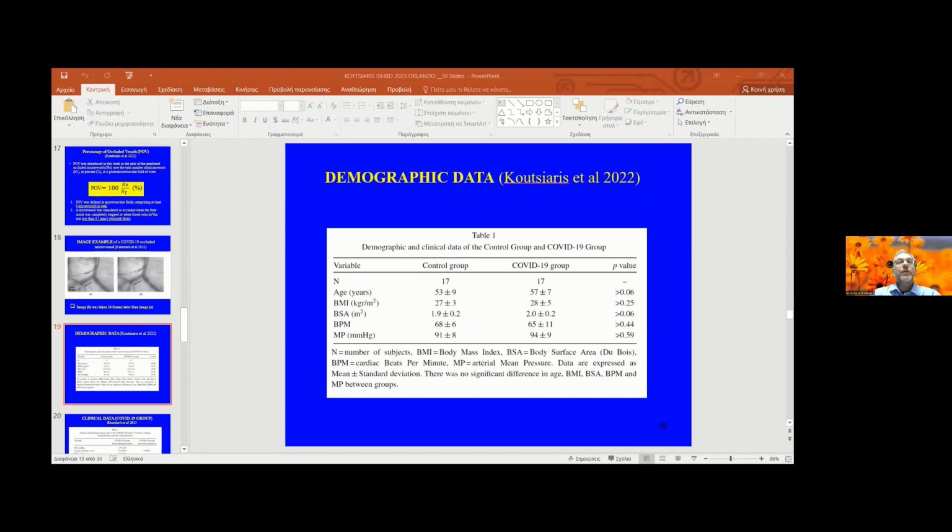And we proceed to the third tissue window for the human body, which is the eye conjunctival tissue. The technique is called conjunctival video capillaroscopy, or CVC. And as you can see, the main component is the slit lamp. The slit lamp here is connected to a CCD camera, the CCD camera to a personal computer. And here is the human eye and the conjunctiva. And images are driven to the personal computer for analysis.